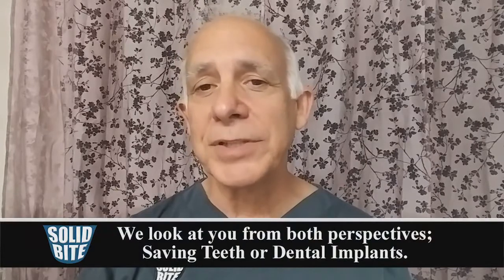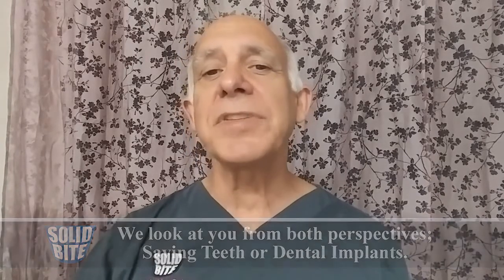Your assistant will show you your Miller-McIntyre Periodontal Prognostic Index. This is scientifically based and gives you an excellent idea of your prognosis as well as your role in successfully treating this disease. While we are known for the most advanced dental implant care, we're very proud of the fact that we save teeth as well. And when we look at a patient, we look at you from both perspectives, saving teeth and or replacement with dental implants. Here are some of the state-of-the-art items that we may use in helping you to treat your disease.